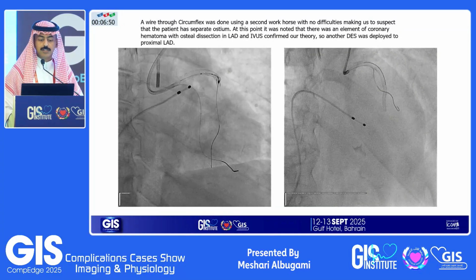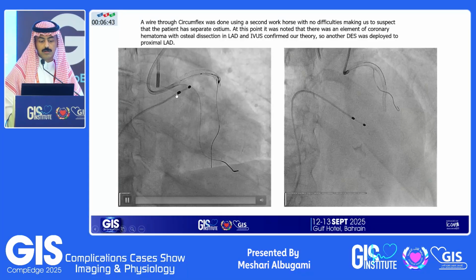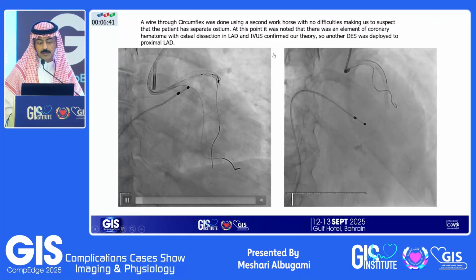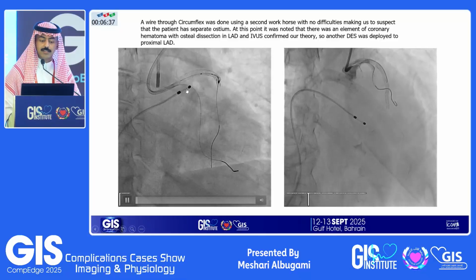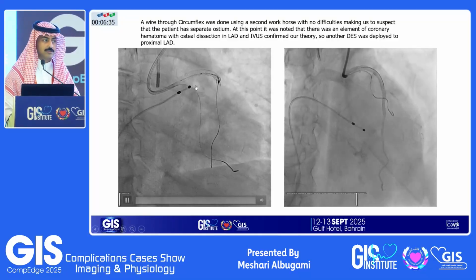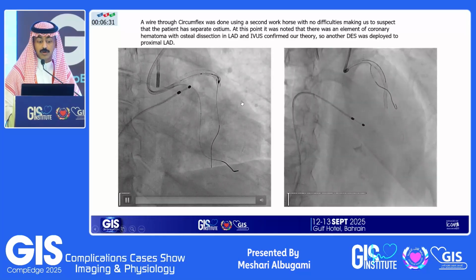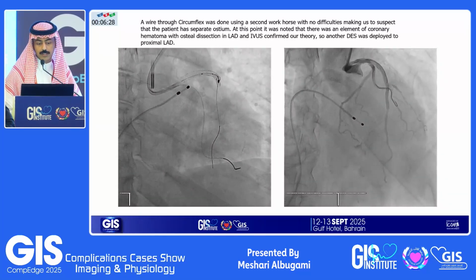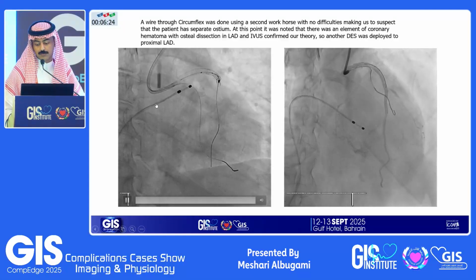Here, it was not clear whether it is a left main, a short left main, or separate ostia of the LAD and circ. So we did an IVUS, which supported our notion that we are dealing with separate ostia. The IVUS also gave us another hint that there was involvement of the ostial LAD by the dissection flap.